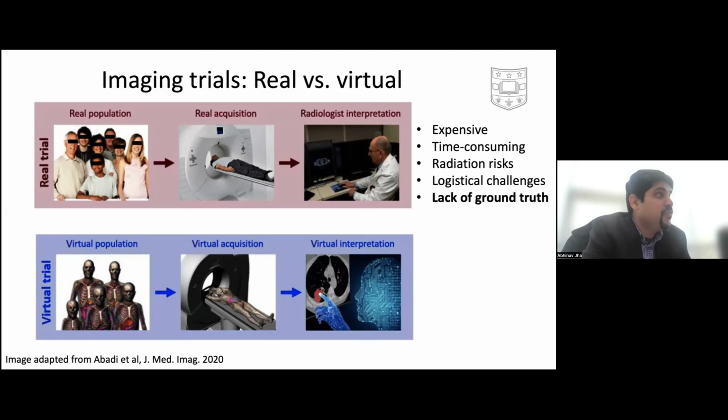You want to do this very accurately. And then you do virtual interpretation. And there's been a lot of work in virtual interpretation using things like model observers, which I also presented yesterday, and their role in being able to quantify detection performance. But here we try to push that towards quantification. How well can we have a virtual interpretation that is quantification based?